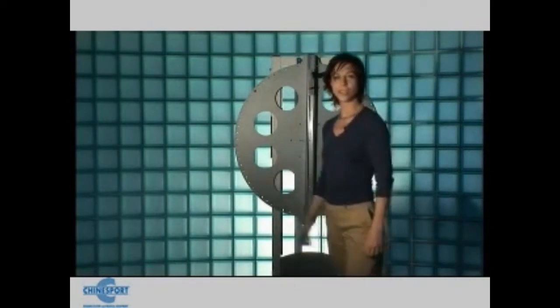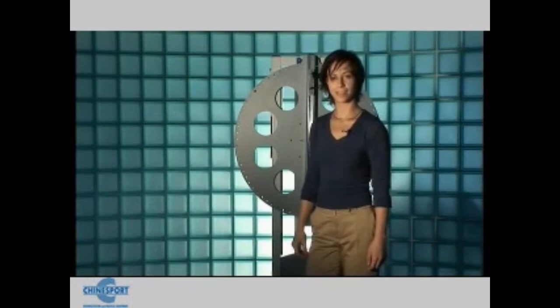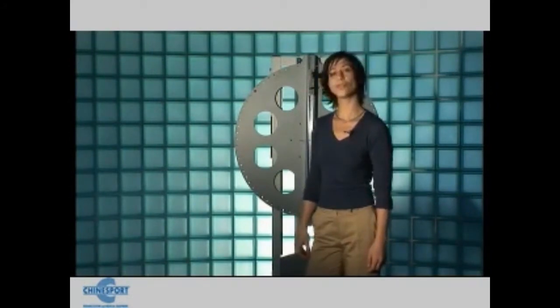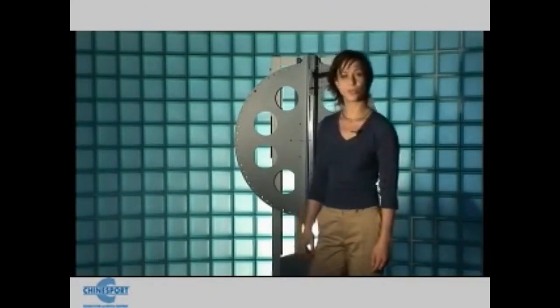This ancient exercise has a number of benefits. First of all, it allows the patient to activate all his kinetic chain. It is a very easy exercise to prepare, and the abduction movement is combined with the external rotation in a proportion that the patient regulates automatically. Let's have a look at the two different executions.